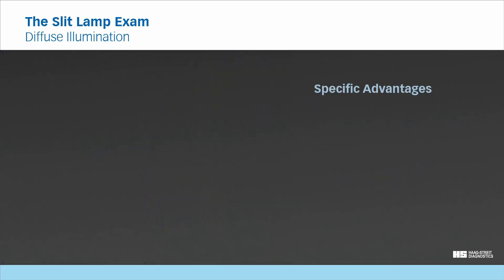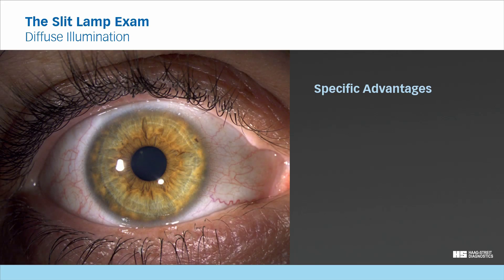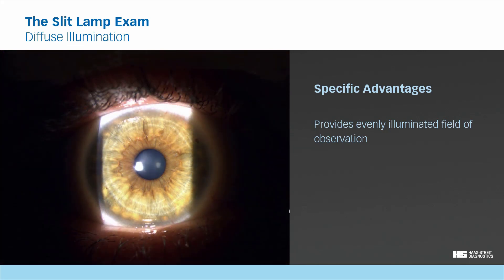Specific advantages. The specific advantage of diffuse illumination is that it provides a uniform light distribution, giving you an overview of a wide field. In comparison, here is the same eye illuminated with direct focal illumination.